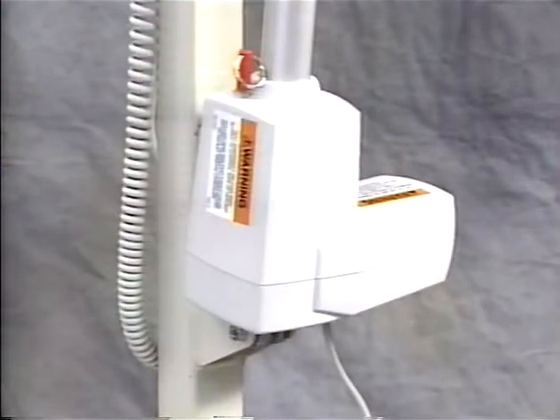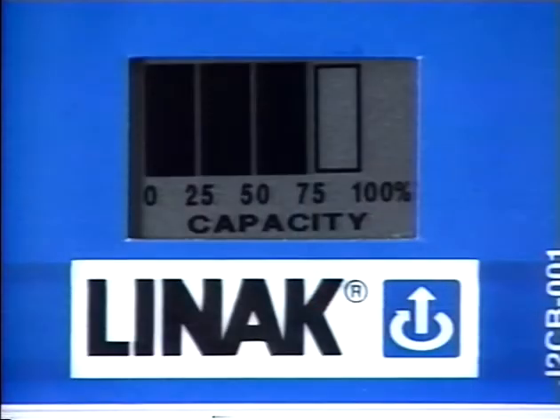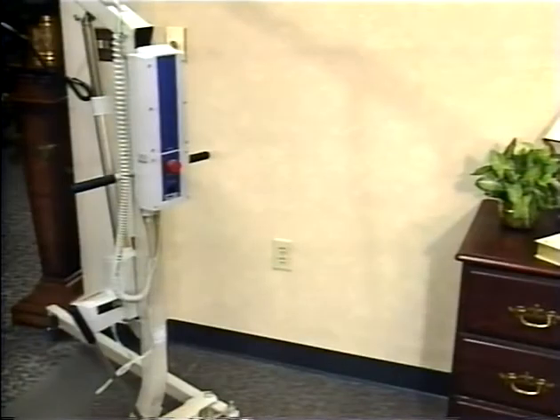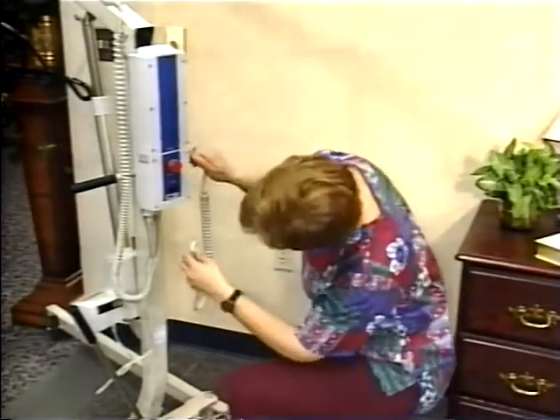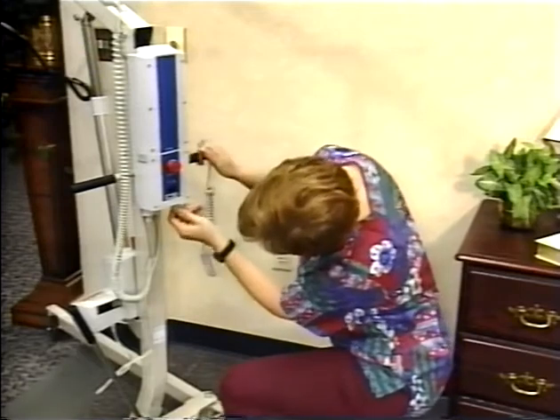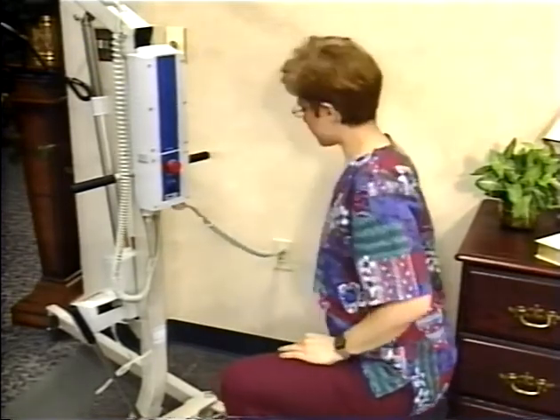Your Hoyer lifter runs on a sturdy, battery-powered electric motor system. When the lift is not in use, the battery charger should be plugged in to ensure a full charge whenever it's needed. Your lifter will run all day on a full charge. The included battery charger cord is enclosed in the power actuator. Just plug one end of the cord into the charging unit and the other end into any regular wall outlet whenever the lift is not in use.